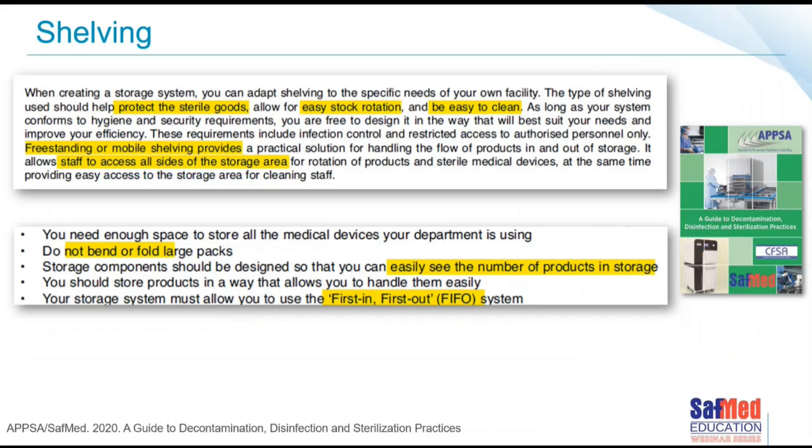Going to a bit more detail from the APSA CFSA manual, let's have a look at this. When creating a storage system, you can adapt shelving to the specific needs of your own facility. That's why it's quite nice if it's shelving that you can design in such a way that you can adjust the height of the shelving. If you've got really big gaps between the shelving, you're going to end up stacking tons of stuff on top of each other, whereas if you put narrow gaps in it, it limits the amount of sets you can put on top of each other.